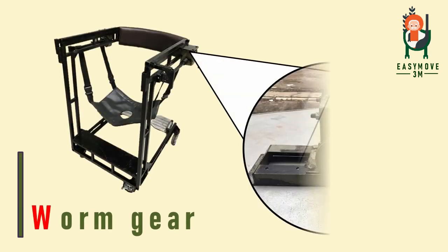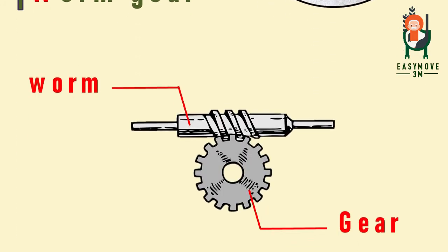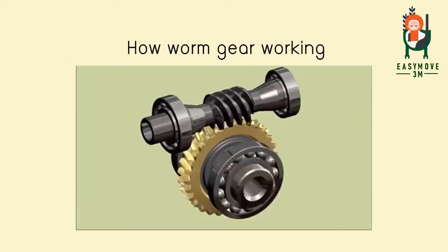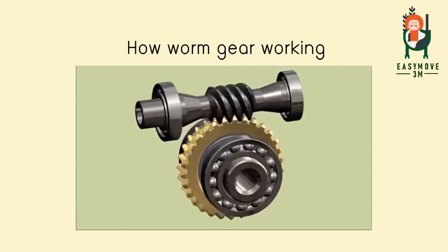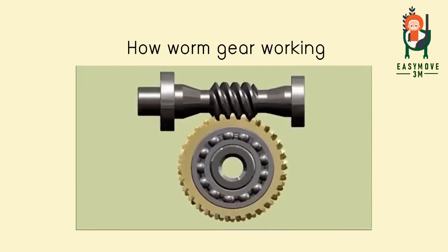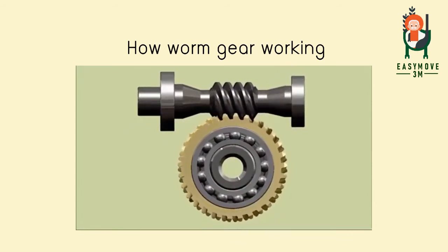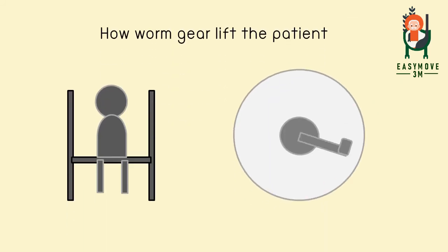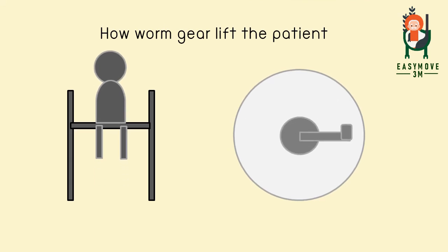Worm gear mechanism. Worm gears are a set of gears composed of a worm helix, which is spiral shaped, placed on a shank. The gear ridge is concave in order to meet the curvature of the worm thread, angled together at 90 degrees. In operation, the drive gear drives the driven gear by sliding. The ratio can be calculated from the distance between the center of the worm gear and the center of the worm wheel. If the center distance is greater, the gear ratio will be greater, reducing our force. With this advantage, we integrated it with a hand crank to speed up elevating the patient easily.